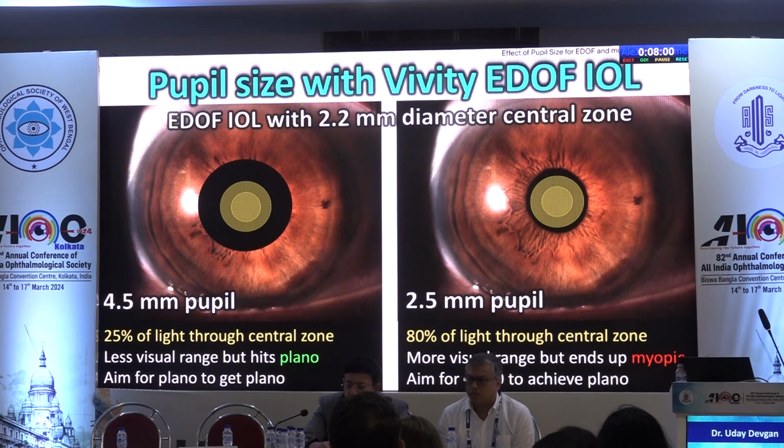So this is really important. This will help you actually nail your target. You have to see for this lens, what's the pupil size.